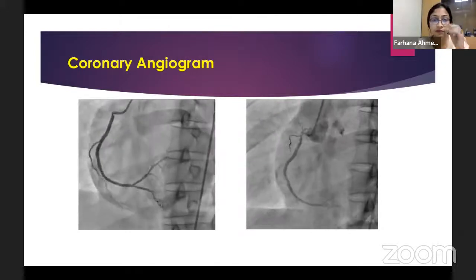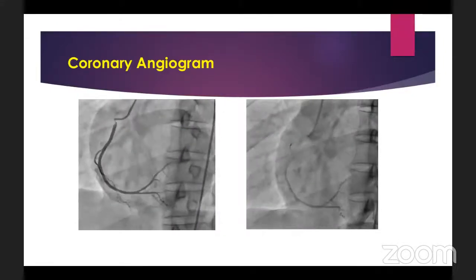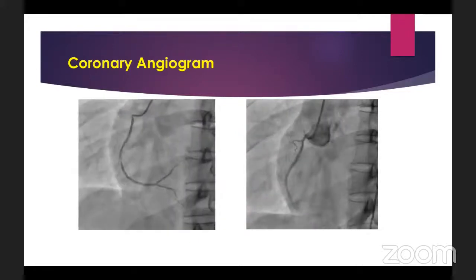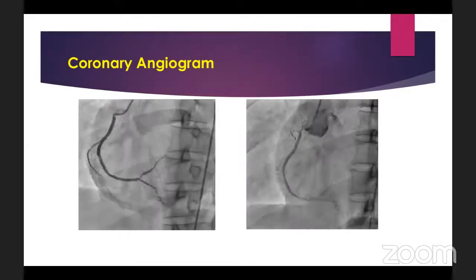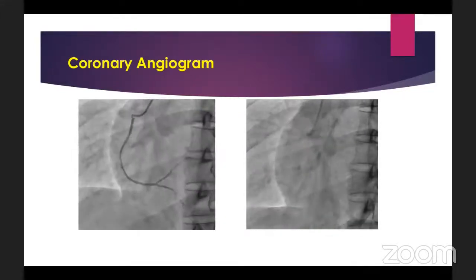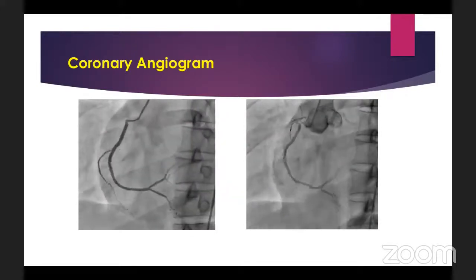Davidson, your comments, please. Or Devashish Ghosh. Hello, am I audible? Yes, you're audible. Yes. Looking at it, basically, I think the lesion is proximal in the RCA as well as ostial. So for an intervention purpose, you will have to cover the ostium here. Though I can't be very definitive about the ostium in the right coronary, because on the right-hand shot, the ostium, the classical junction between the artery and the aorta, seems reasonably open. So it's a proximal ostial lesion.